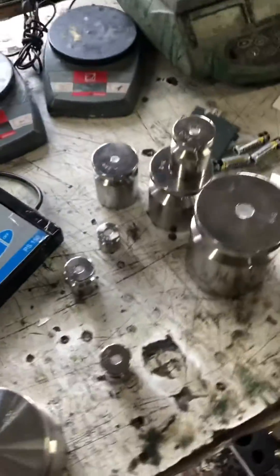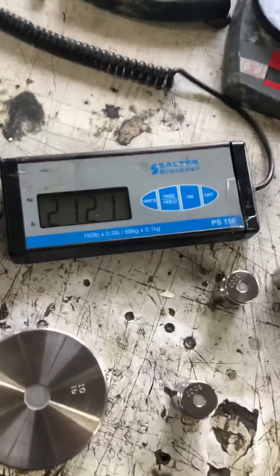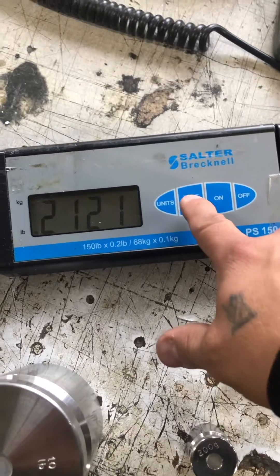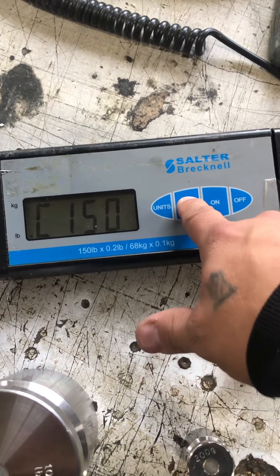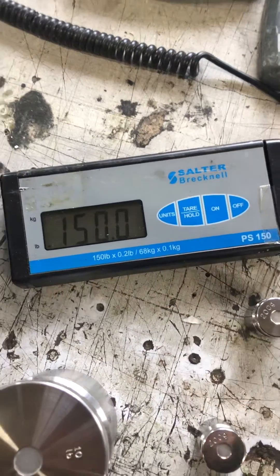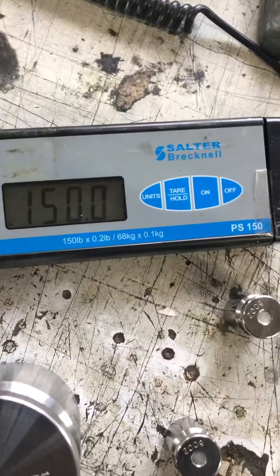Give it a couple of seconds to stabilize, and then basically you press here and hold it until it reaches 'end.' And that's how you calibrate or adjust the calibration of a Salter PS150.